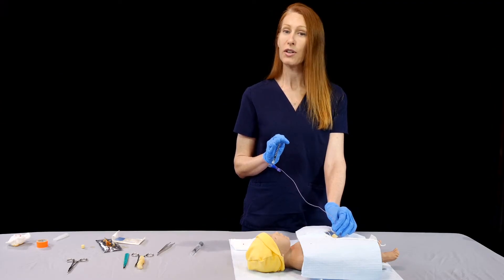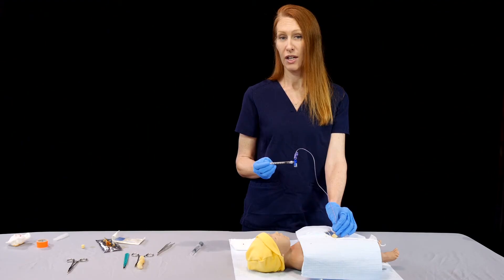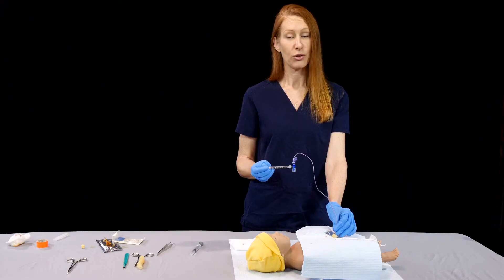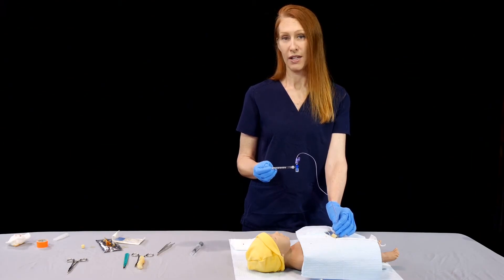If by four to five centimeters you have not gotten blood back from the syringe that you're aspirating with, you may be in a false lumen. In that case, consider removing the line and trying again after ensuring that you're in the lumen of the umbilical vein.